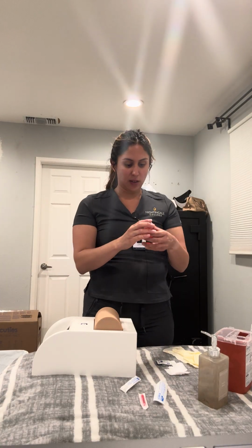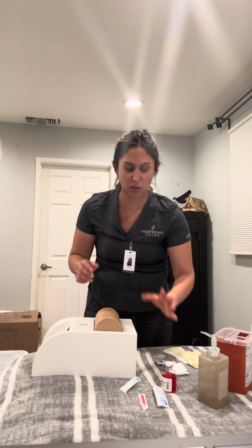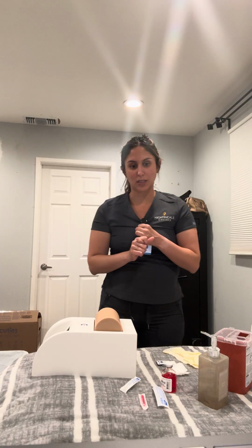First, I'm going to go to my EHR and verify that the doctor has ordered morphine 6 milligrams IM for 1 dose for the patient for pain. The vial that I have reads morphine sulfate 4 milligrams per ml, so I'm going to be giving the patient 1.5 mLs for this injection. Once I've verified it, I'm going to make sure I do my 6 rights: right patient, right drug, dose, time, route, and documentation.